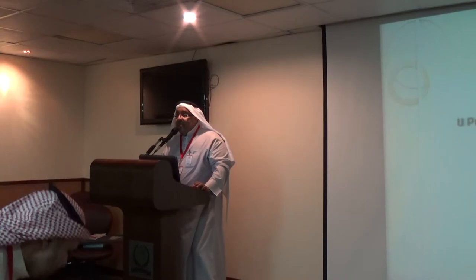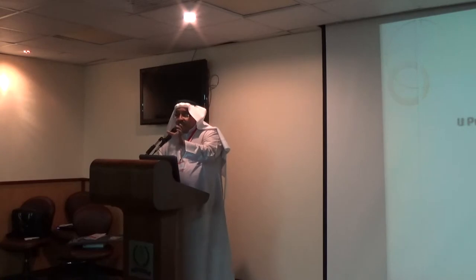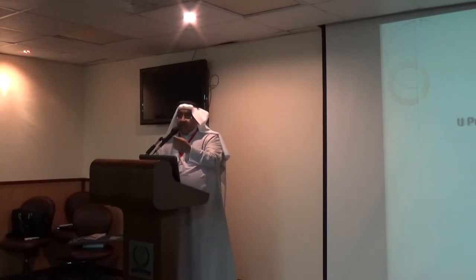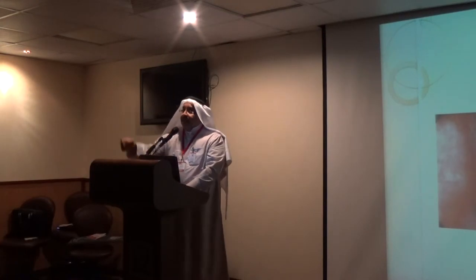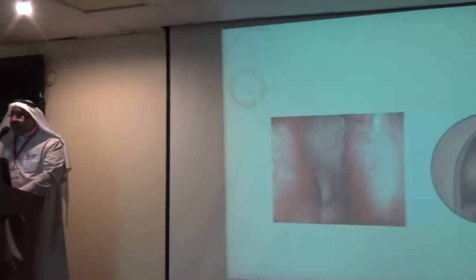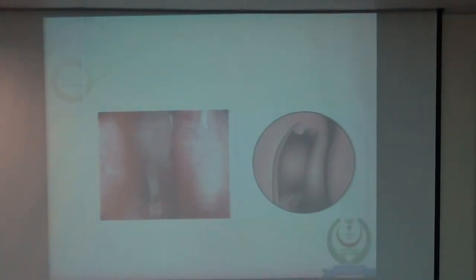So I will talk for 10 minutes about the uncinate process and middle meatus antrostomy. And Dr. Sam Mergarani will talk about the middle turbinate and anterior ethmoid. Those two parts will be the dissection, the demonstration, and your dissection. So the uncinate process, we know it's a G-shaped process. It's hiding the middle meatus. Can I have a pointer? Yes, pointer. It's hiding the natural ostium. If you don't remove part of it, you will not see the natural ostium.